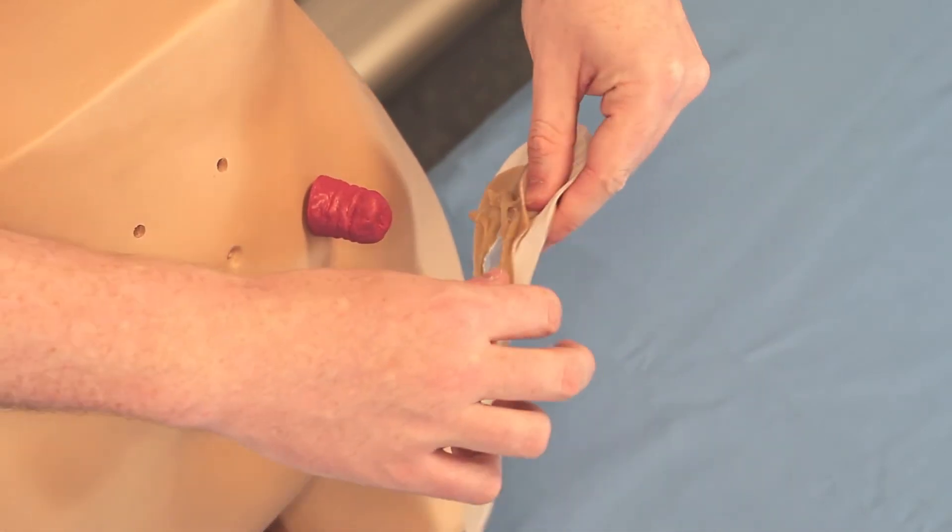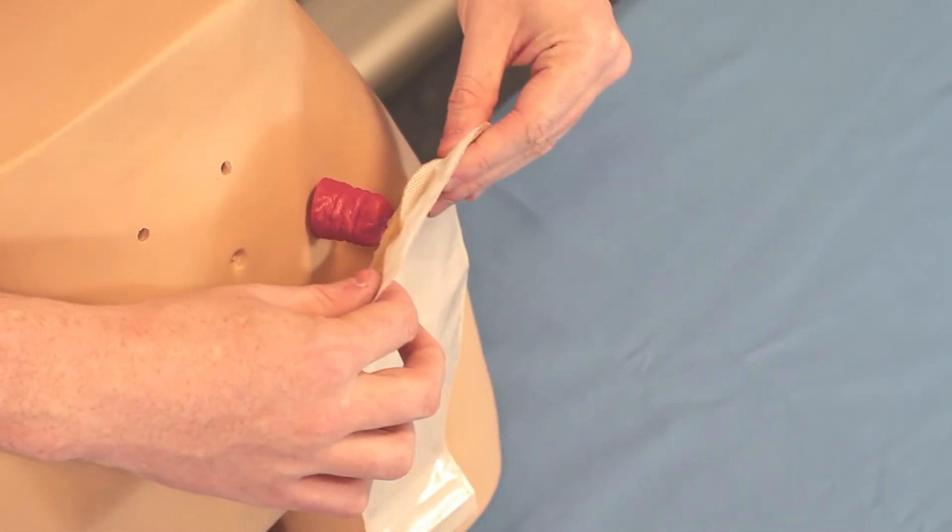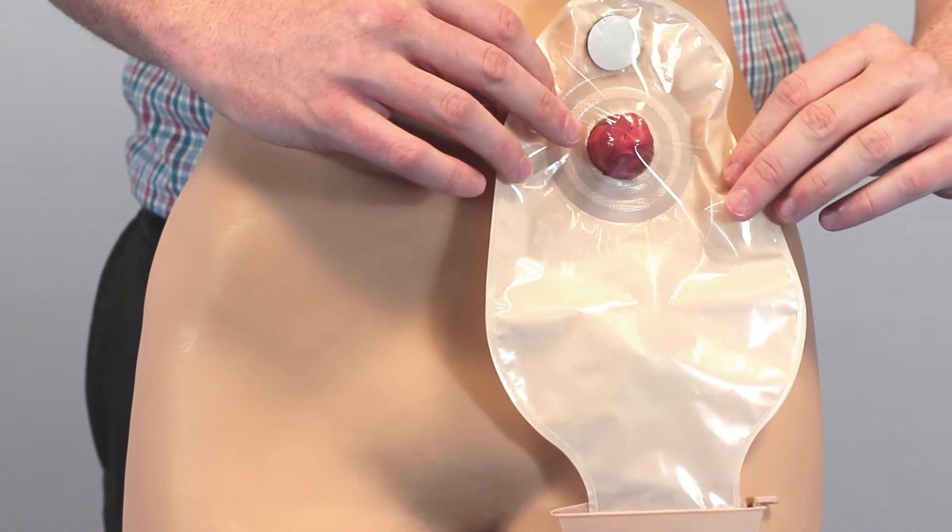Now the pouch can be applied. As you can see, the stoma paste will fill in any irregularities in the body.